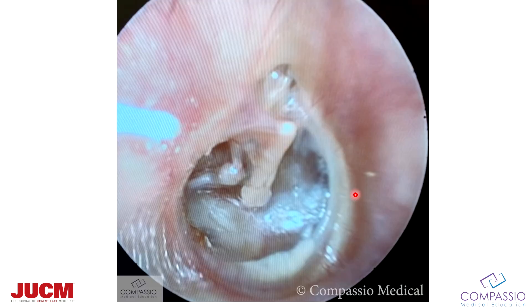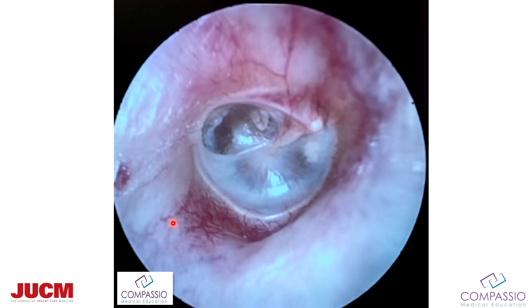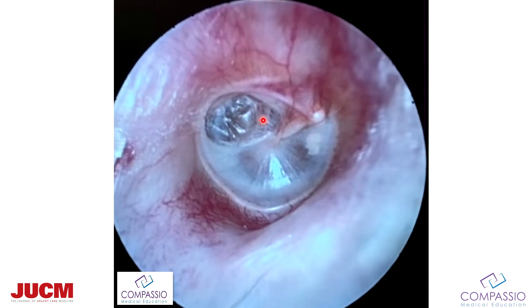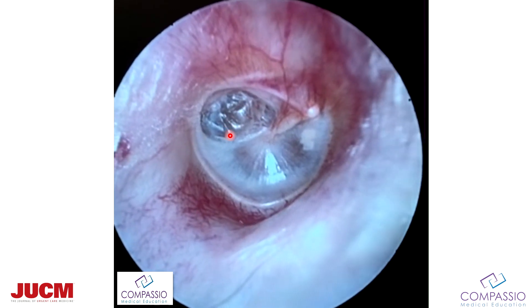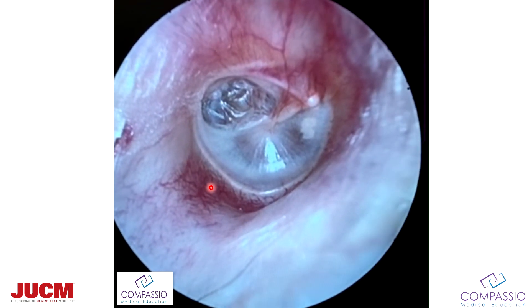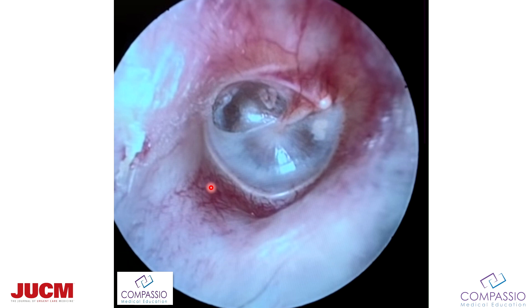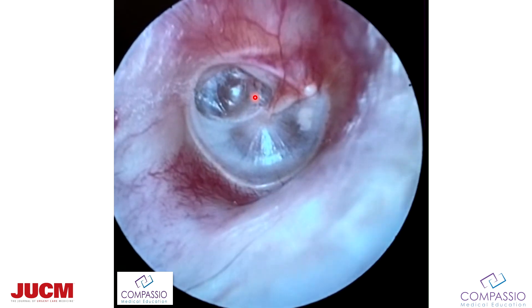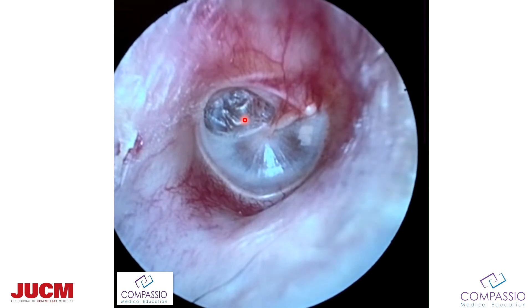Here's a severely retracted pocket — a right ear showing the stapes. You shouldn't see that, and these patients should be referred to the ENT. I had the patient clear his ear and notice how thin that portion of the eardrum is — that's why it looks like a perforation sometimes. Here we are having them suck in and then blow out again, and you can see it's a very thin tympanic membrane.